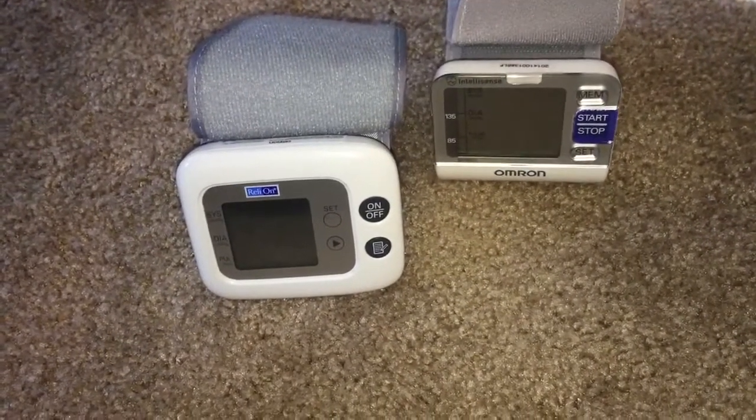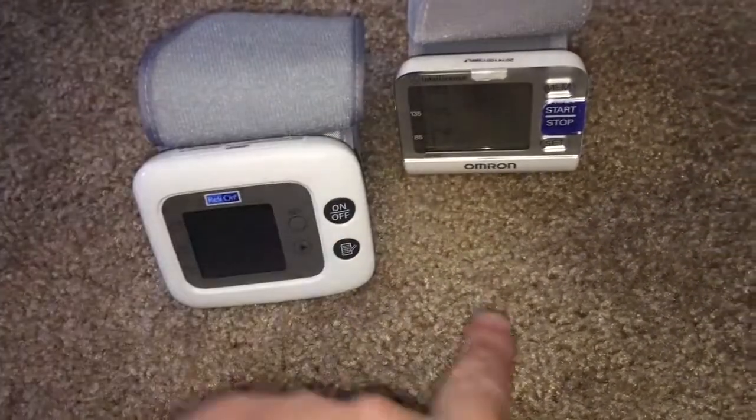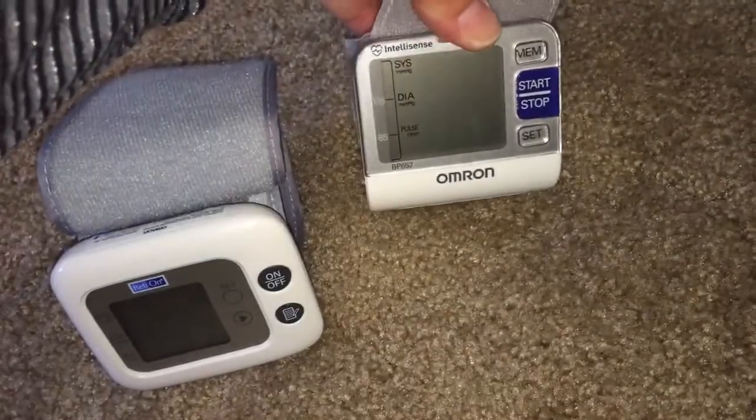This is a video comparing the RelyOn blood pressure cuff monitor and the Omron blood pressure cuff monitor — this is the one with IntelliSense. Before we get started, I'll show the model numbers in case anyone's interested.